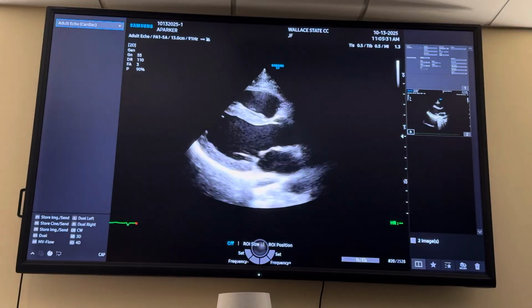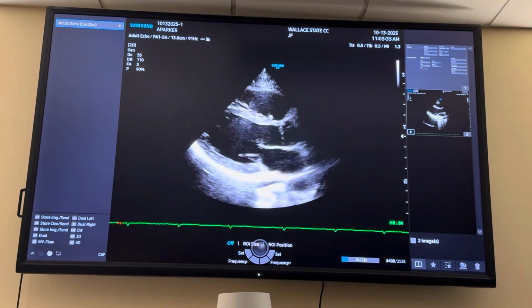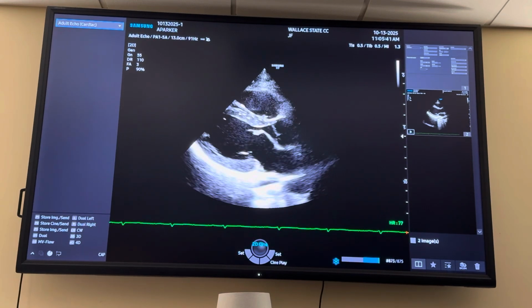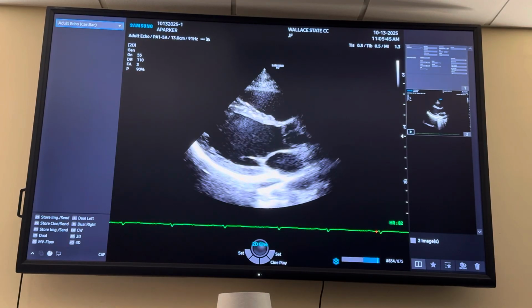That's what you want. And then here, now we're going to start measuring your interventricular septal wall, your EF. I'm going to get a good image here, standard depth, and I'm going to scroll through to end diastole. You can see where my marker is, at the very end of the QRS here, and you can also see as I'm scrolling through.